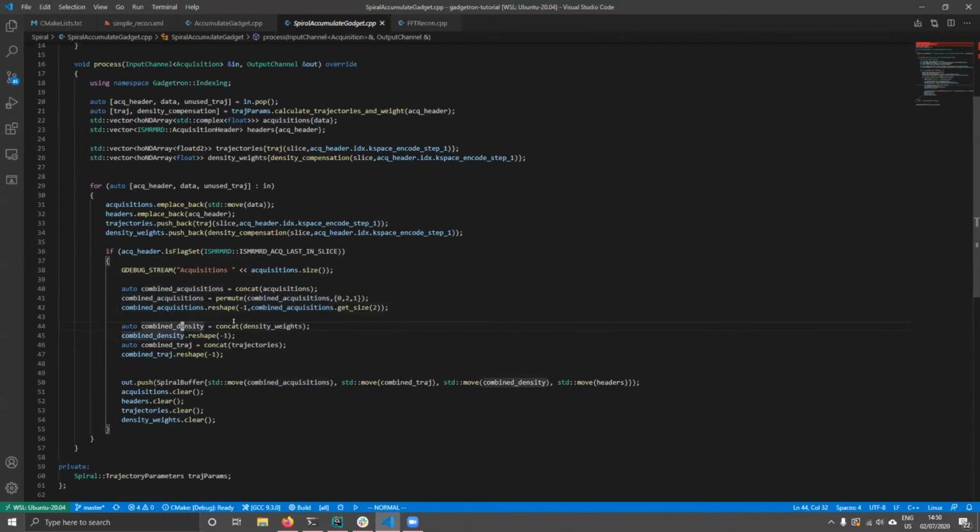For the density compensation, again, we do much the same thing. We call concat to create one combined array. We call reshape, and I should mention the -1 means that it should just infer the dimension. So if you just have -1 here, you're making a one-dimensional array. And we're pushing that into a spiral buffer, which I'll come back to, moving things onto there. And then we're clearing all the standard vectors.